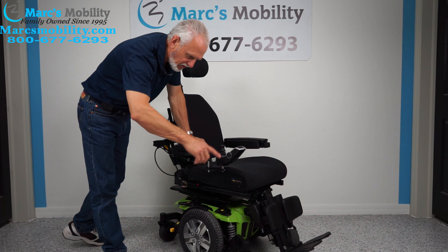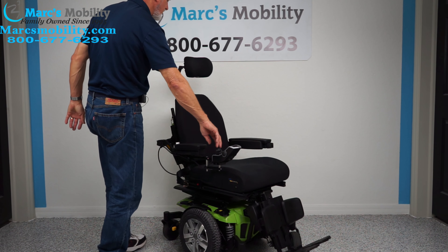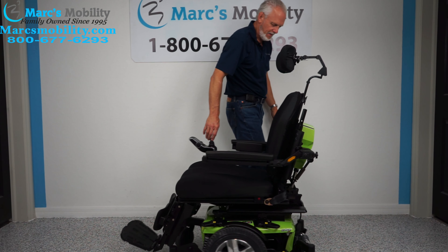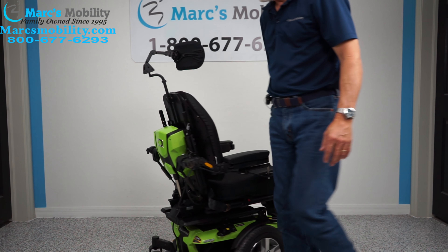It's a mid-wheel drive chair, so it turns around its own length. If I do this, it'll turn around its own length all day long.